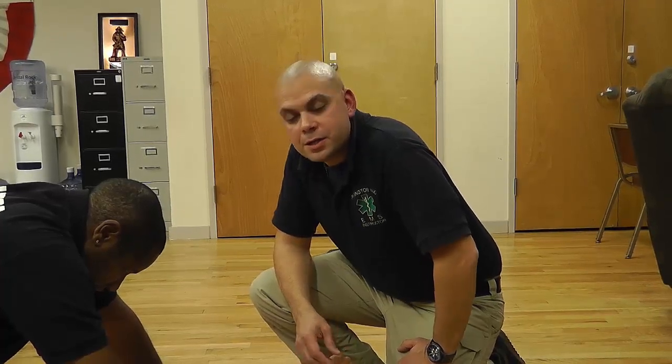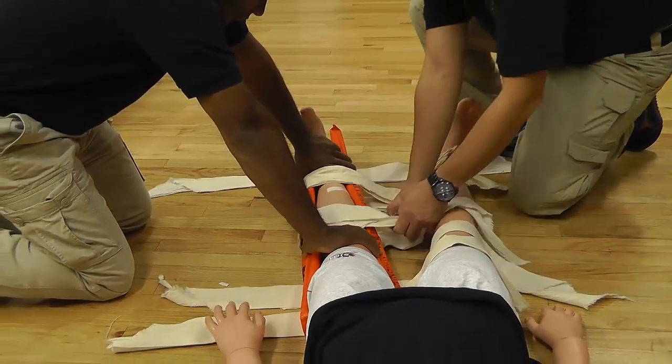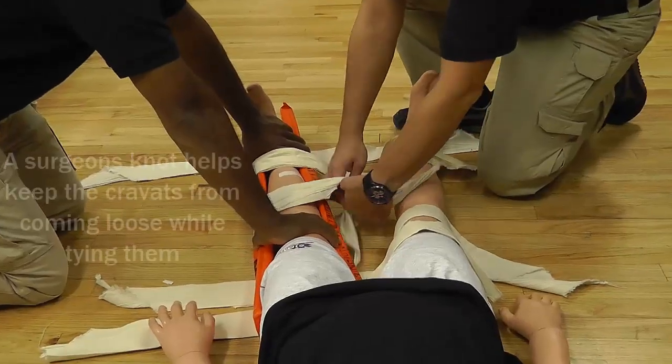Now I'm going to tie off my cravats. I'm going to start with the two cravats that are directly above and below the injury site. I'm going to make sure that I tie my knots against the board and not the patient's leg. So I'm going to bring my cravats towards me and make a knot using a surgeon's knot technique.